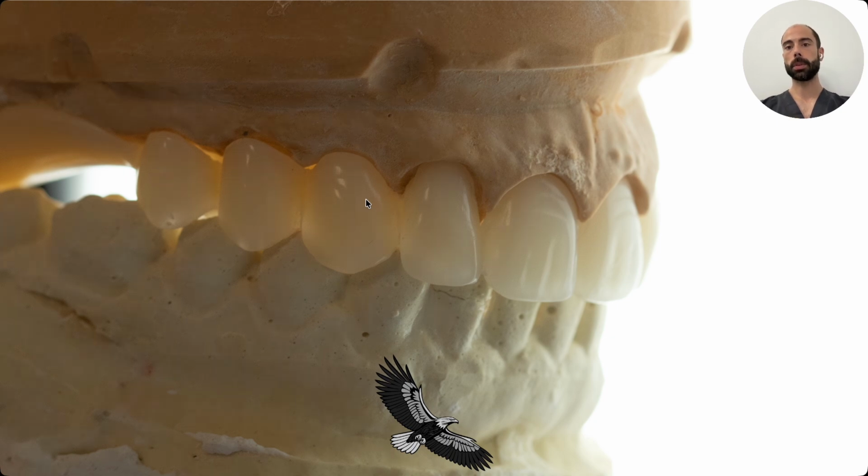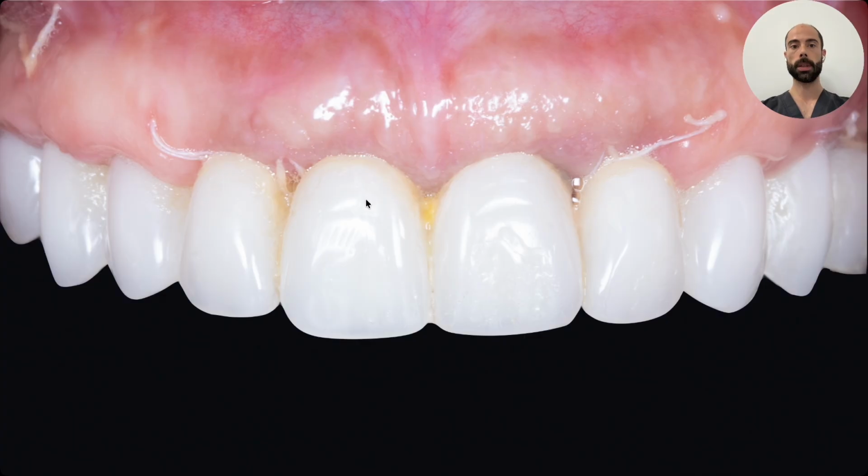And I know some of you will push back on this. I still do this conventionally, not digitally, not milled, not printed. And why? Because the aesthetics are unmatched. A conventional pickup done carefully gives you a surface texture, a translucency, an optical quality that no printed provisional matches today. And milled provisionals, apart from the cost, they take time you don't have intraoperatively. This technique, as described by Gallucci, remains 20 years later the gold standard for full-arch immediate loading provisionals.